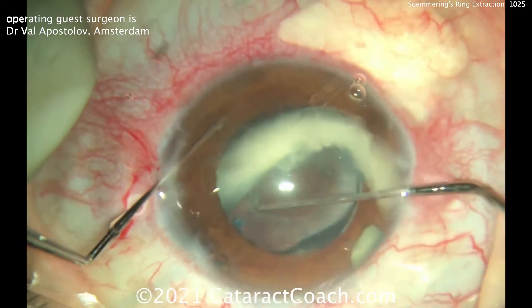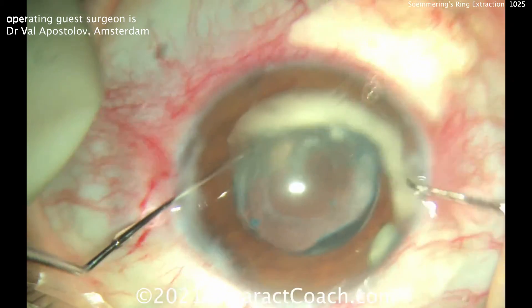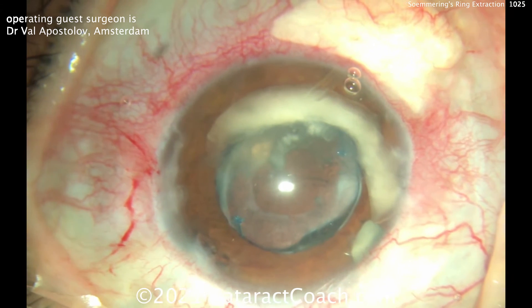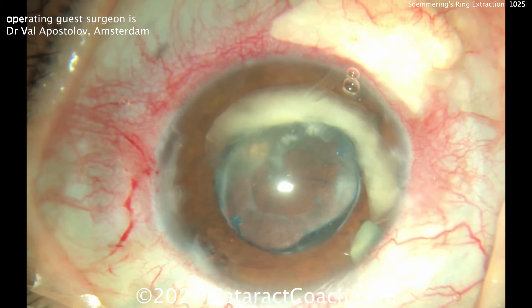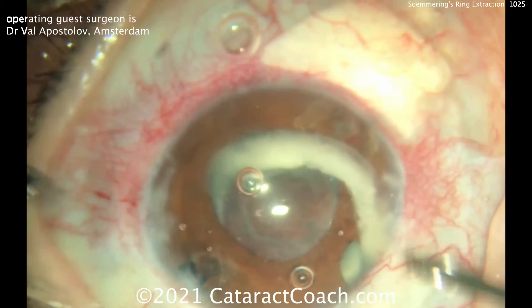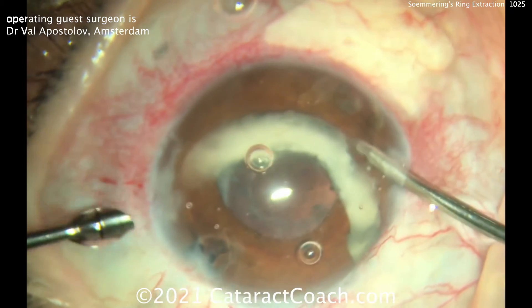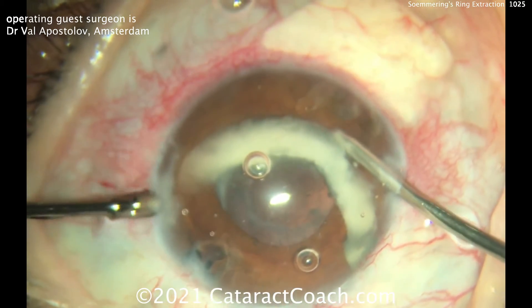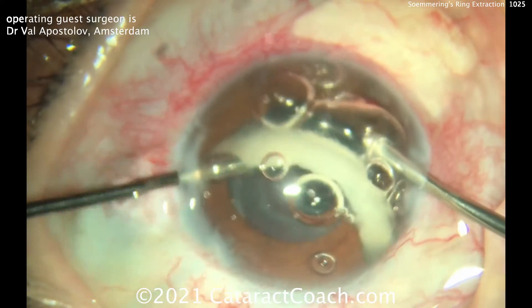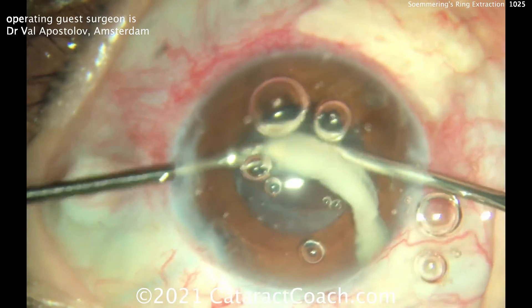There it is — about half of it. Wow! This obviously happened over the course of many, many years. How do you remove it? He's going to do something very innovative: a bimanual phaco technique. He'll use a phaco probe with just the phaco needle in his left hand — no sleeve on it — through that small side port, and then the right hand has the infusion.